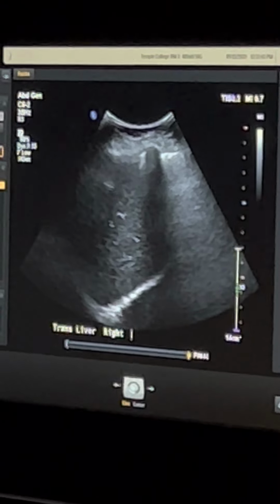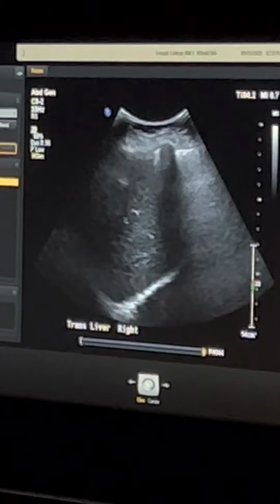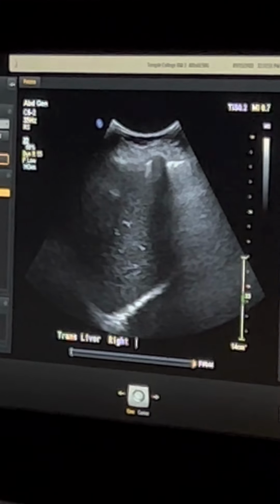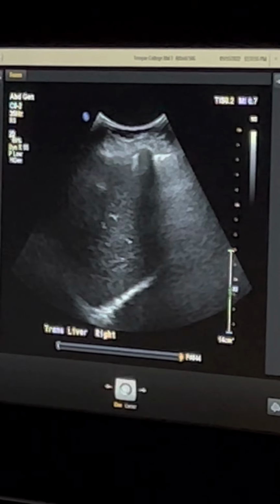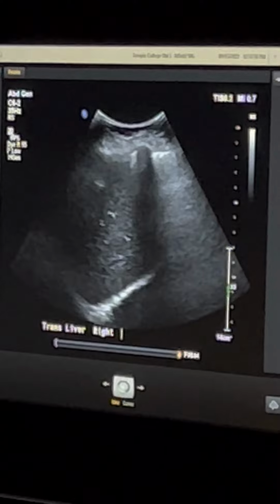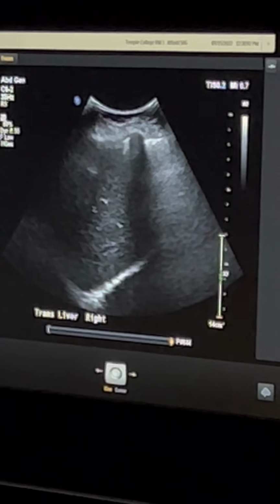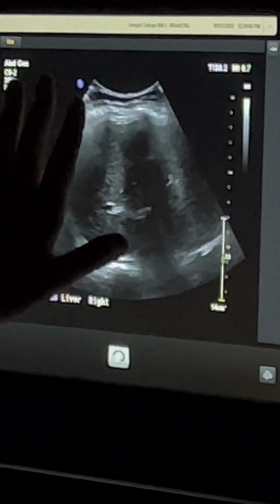We are scanning an oppositely curved surface from our probe, right? So it's gonna be harder to get that contact up on the ribs, especially when you have these real bony patients, right? Usually you're older folks. So you're gonna put those gel pads essentially there and go back to where you want it to be, and now look, no contact loss.